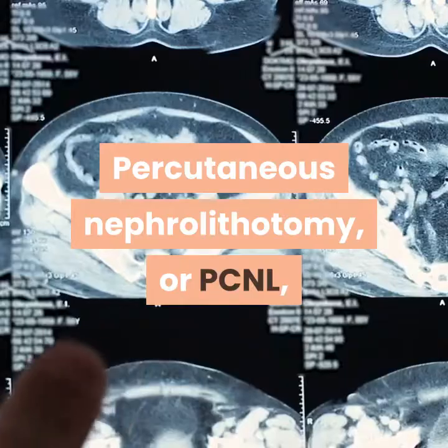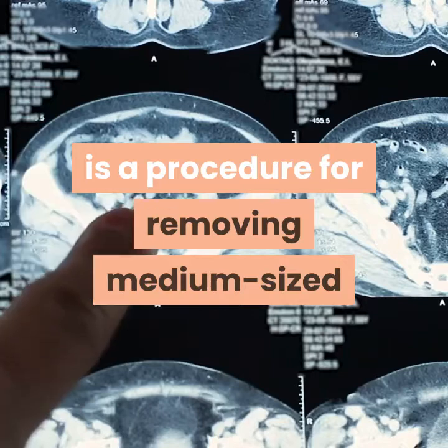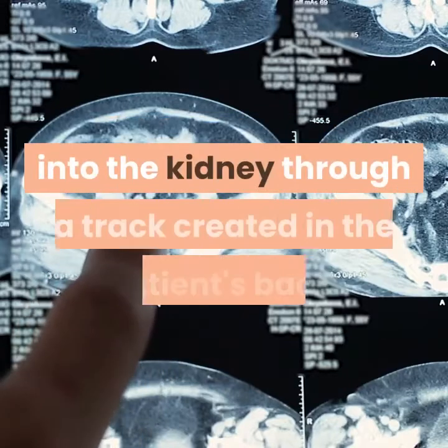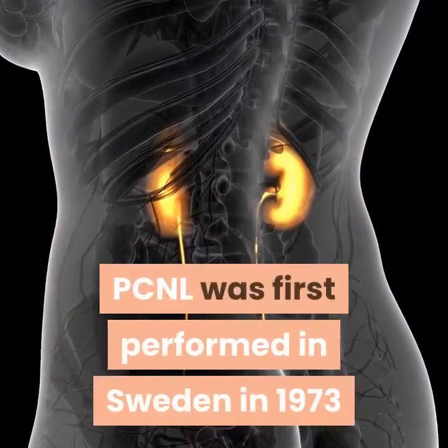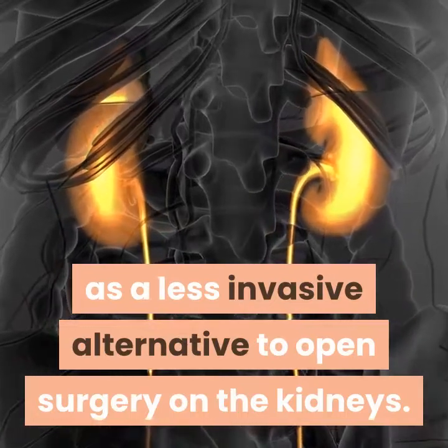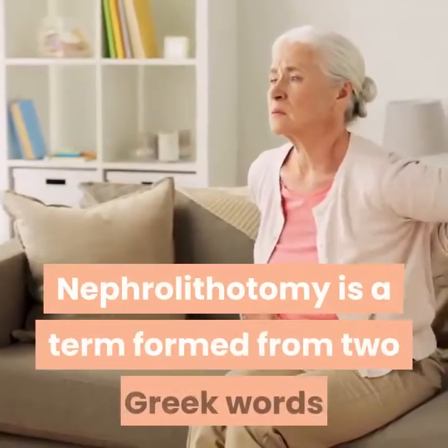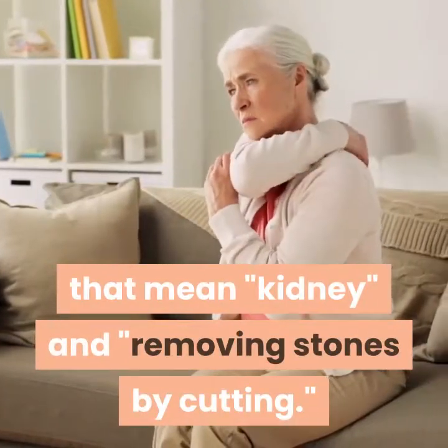Definition: Percutaneous nephrolithotomy, or PCNL, is a procedure for removing medium-sized or larger renal calculi (kidney stones) from the patient's urinary tract by means of a nephroscope passed into the kidney through a tract created in the patient's back. PCNL was first performed in Sweden in 1973 as a less invasive alternative to open surgery on the kidneys. The term percutaneous means that the procedure is done through the skin. Nephrolithotomy is a term formed from two Greek words that mean kidney and removing stones by cutting.